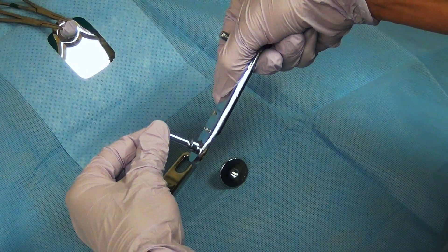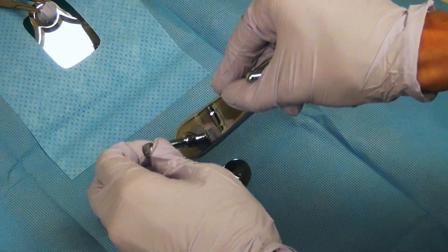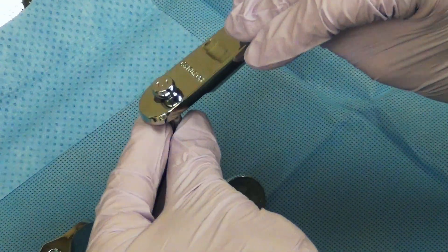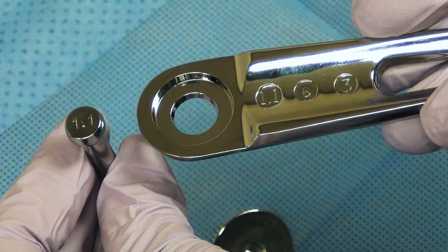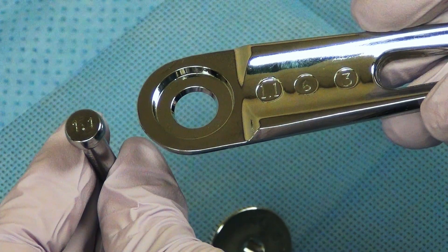First, the clamp is inspected to ensure a matching size bell and base. Most Gomco clamps are inscribed on the post of the bell and the underside of the base with their respective sizes.